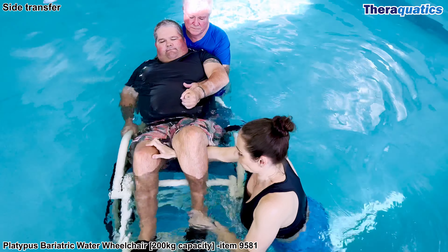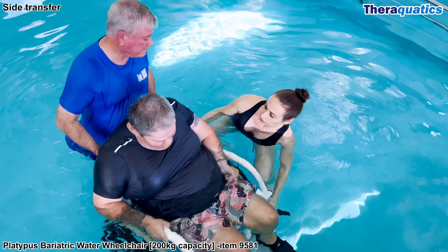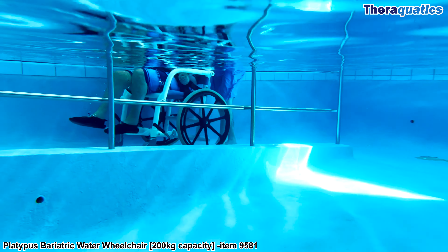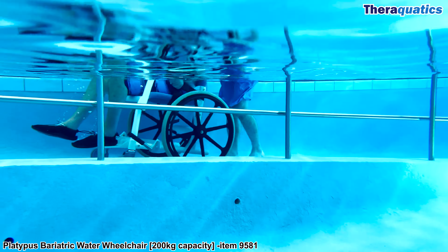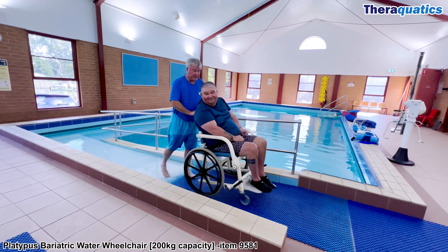Often knee mobilisation is required for correct foot positioning on the foot plates. The support worker lifts up the chair into an upright position and pushes the water wheelchair forwards up the ramp to maximise safety. Remember: when entering the pool, carefully walk the water wheelchair backwards down the ramp.